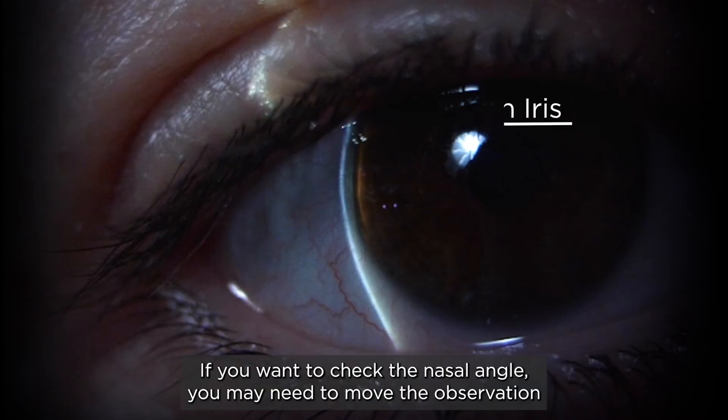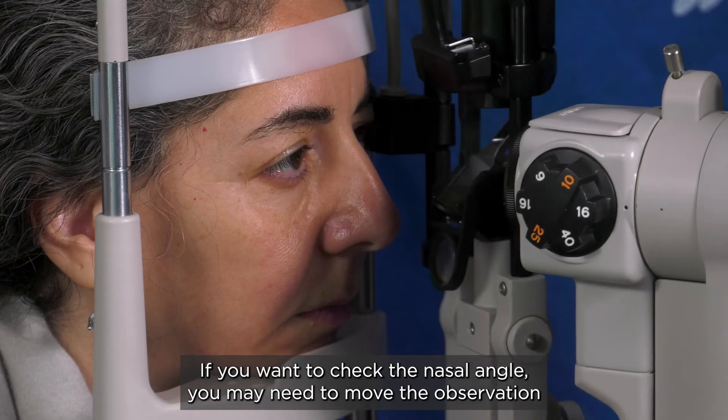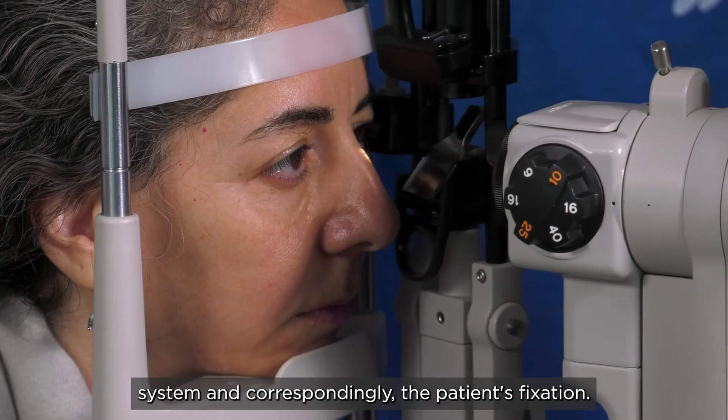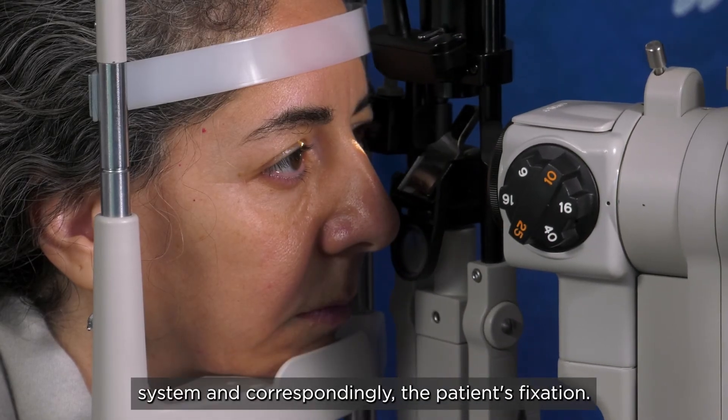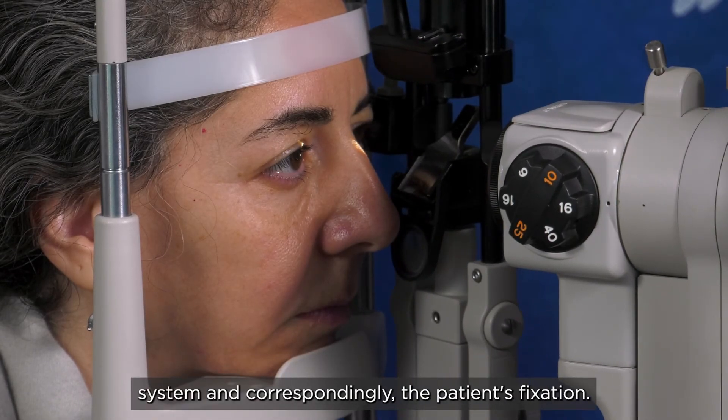If you want to check the nasal angle, you may need to move the observation system and correspondingly the patient's fixation.